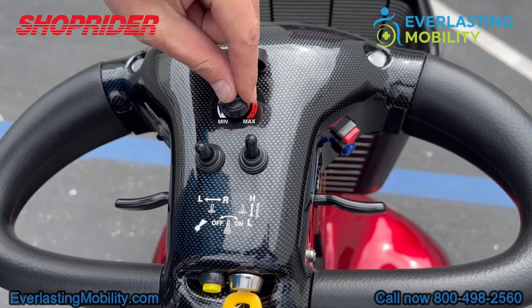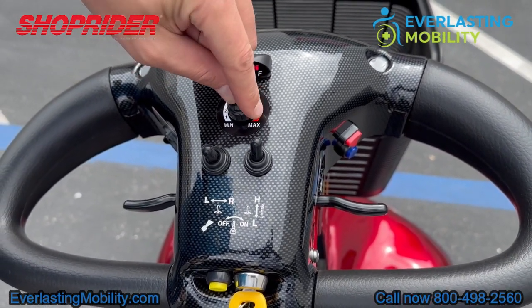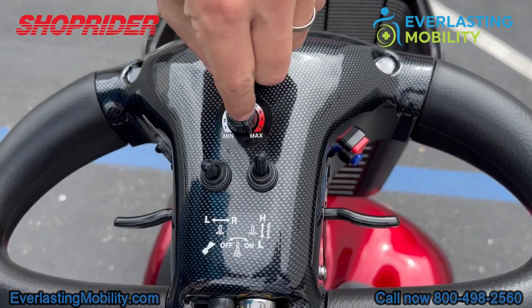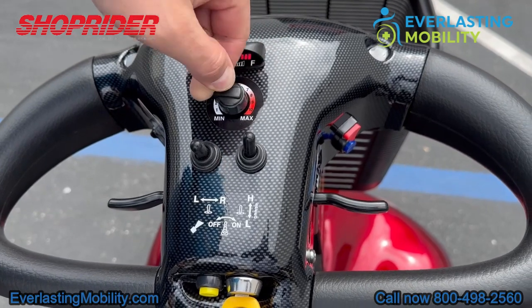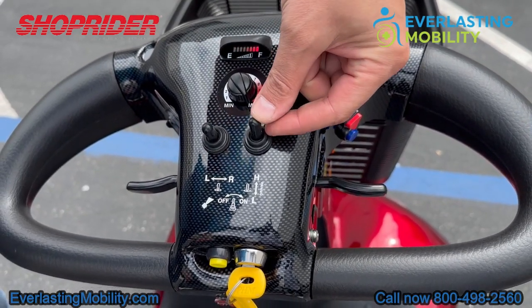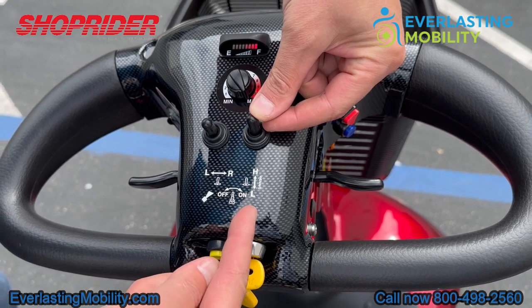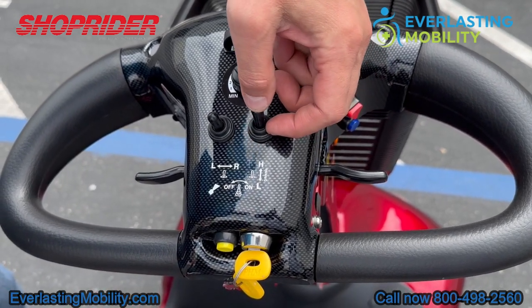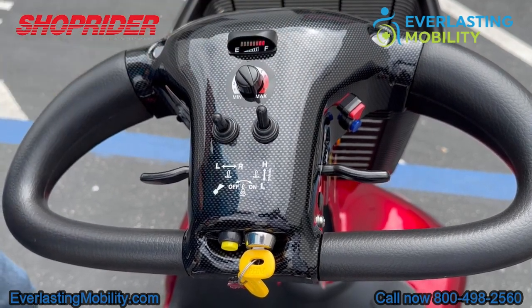This is the speed control dial. Turn it all the way to the right for maximum speed, and all the way to the left to decrease your speed in half. There's also a supplemental speed control switch located right here, so you can put that into either high or low gear and then use the dial to adjust speed in either gear.